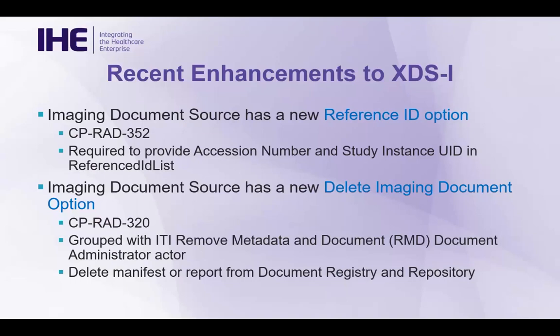Recently, we did say it should be using the ITI metadata update profile, but then even ITI has recently updated how metadata update should be handled. So this CP now catches up with all the changes, and explicitly makes use of the ITI Remove Metadata and Documents profile, the RMD profile, by grouping with the Document Administrator actor.